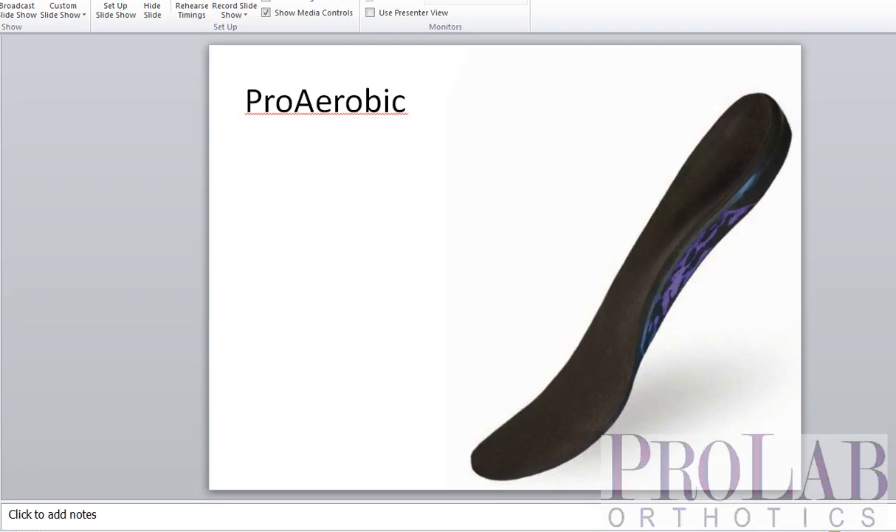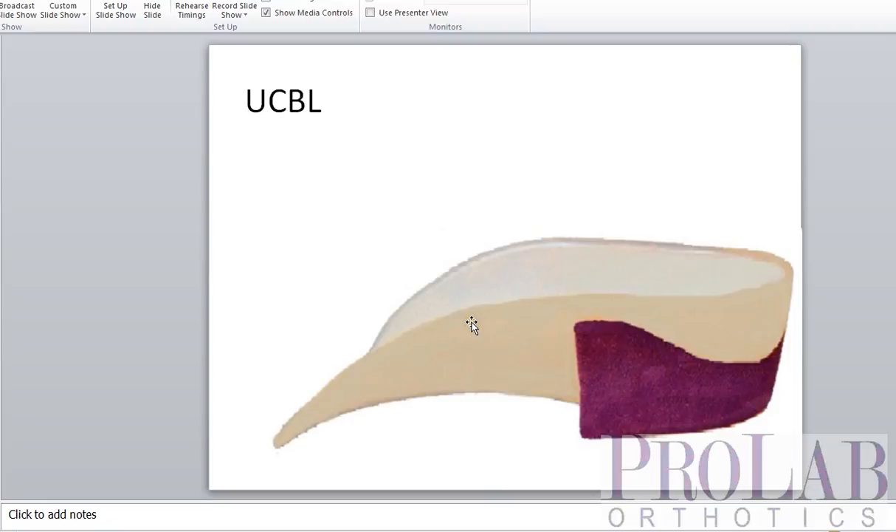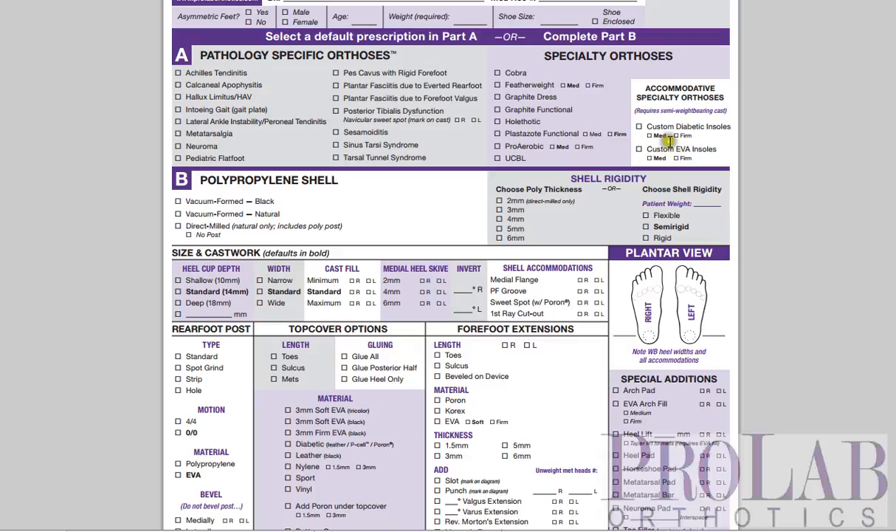Finally, we have a UCBL orthosis. This is a standard UCBL with a very deep — about 30mm — heel cup, both lateral flange and medial flange, and a rear foot post. The only difference between this and a traditional UCBL is that this is a balanced cast, meaning the forefoot is balanced to the rear foot, which should provide even better support than a standard UCBL.